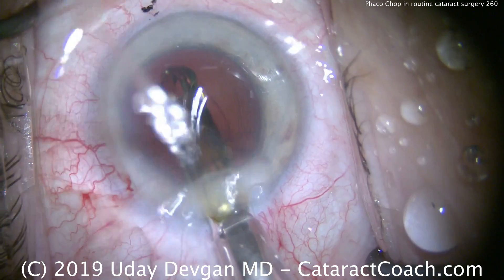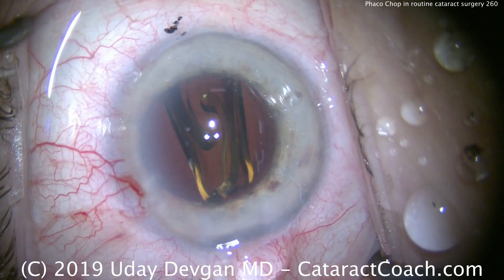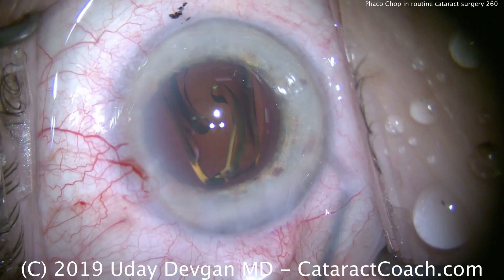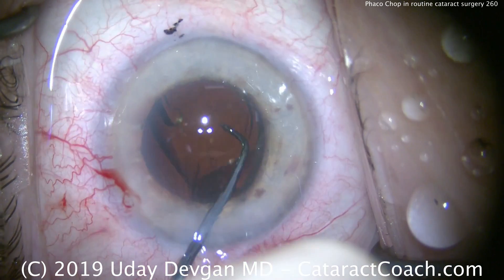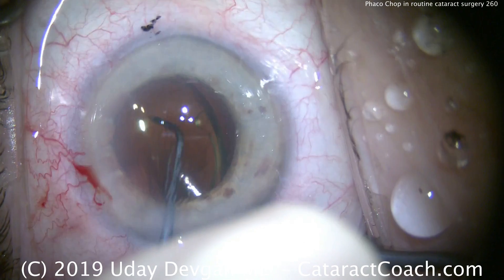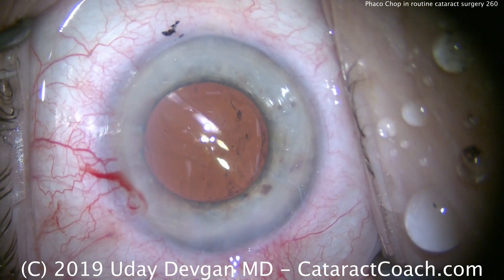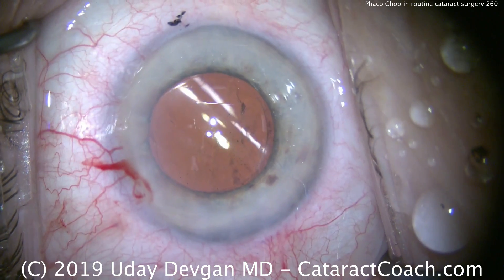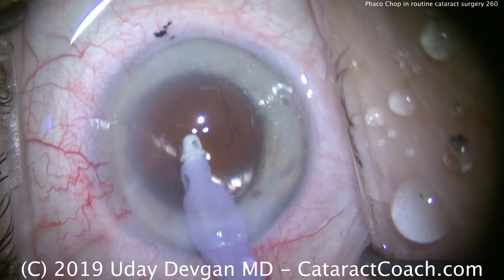Here's the lens being delivered inside the capsular bag — comes out beautifully. The technician did a great job unloading that. We're going to allow the lens to open up, make sure it's completely in the capsular bag — both haptics and the optic. We'll rotate this lens a little bit. This patient is getting a toric lens. Look how big that 6mm optic looks — in fact, we did have a 5mm rhexis, and this patient's dilation is actually less than 6mm.